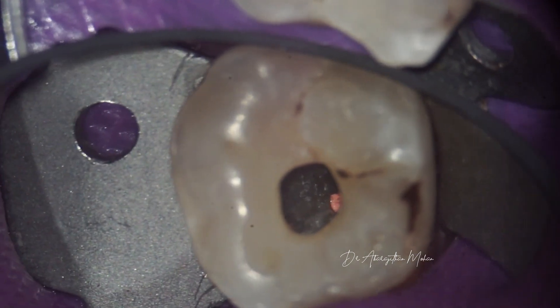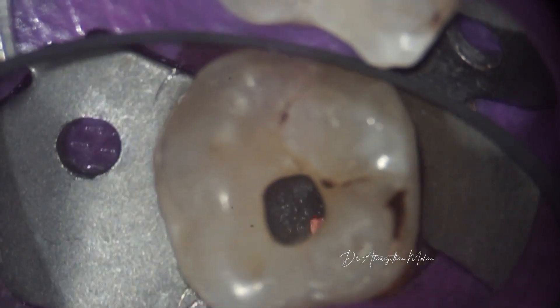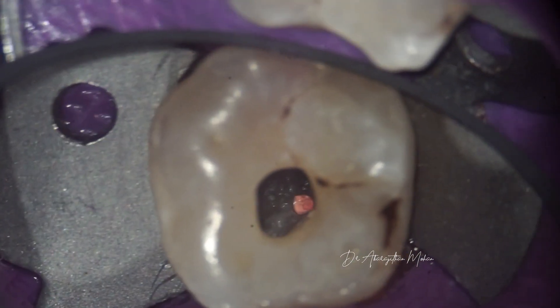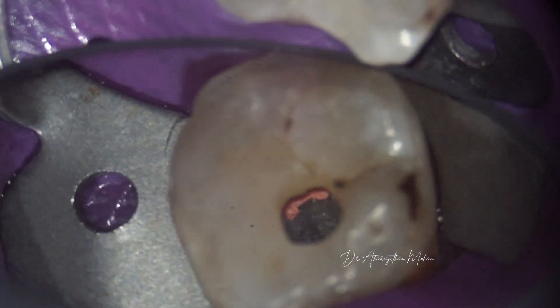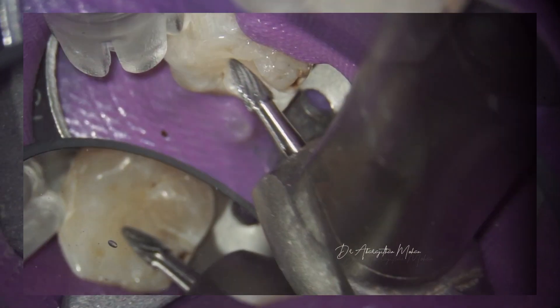This is the final obturation after all canals are thoroughly cleaned. In conservative access, people always worry about access to all the canals. You can see that with good mouth mirror control, you can still have good access to all the orifices in spite of such a narrow access cavity preparation.